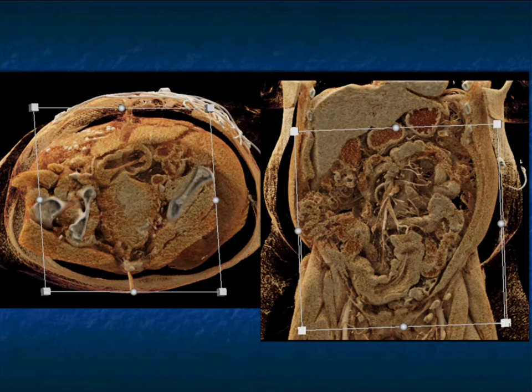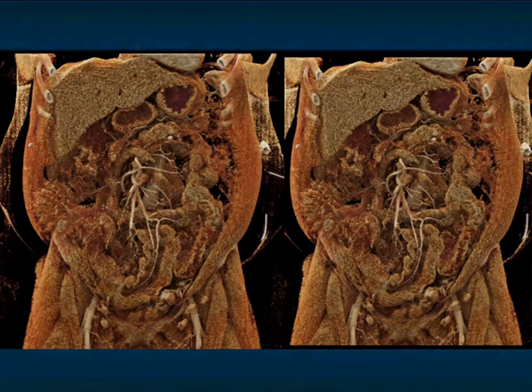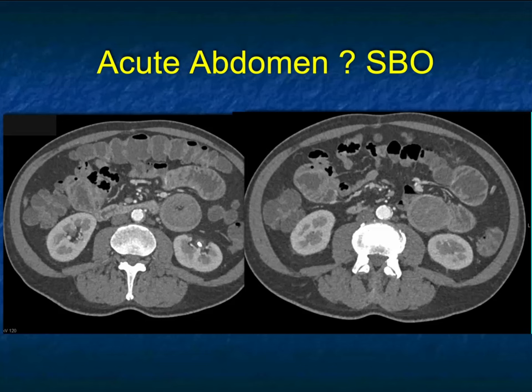I will look very carefully at the lead point. Is it a lipoma? Then I'll see fat. Is it a solid tumor? Then I can think about things, or do I see nothing and wonder if it's just some other cause that's not a tumor? Just a very, very nice example of that.